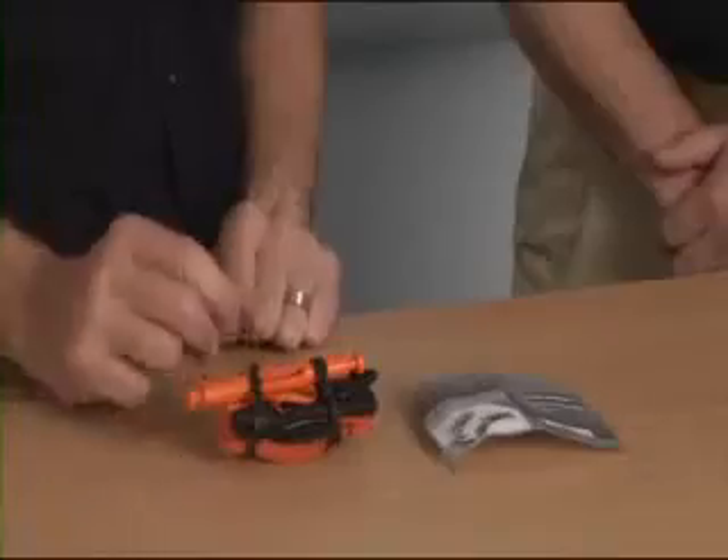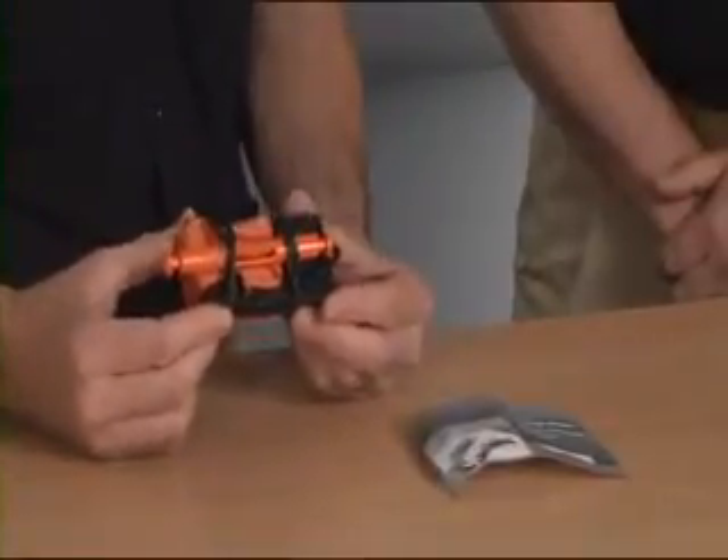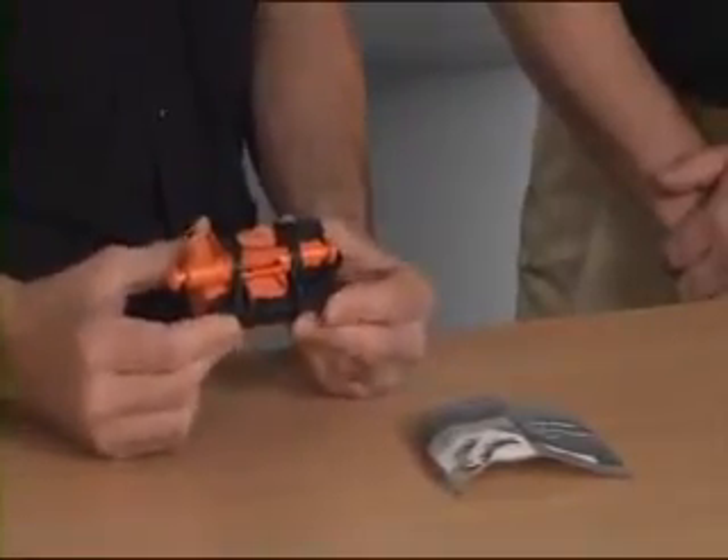I'm going to talk about the Soft TW tourniquet. This is an arterial tourniquet that was designed originally for battlefield application, but it has its use in any major limb compressible hemorrhage where we're struggling to gain control of the bleeding.